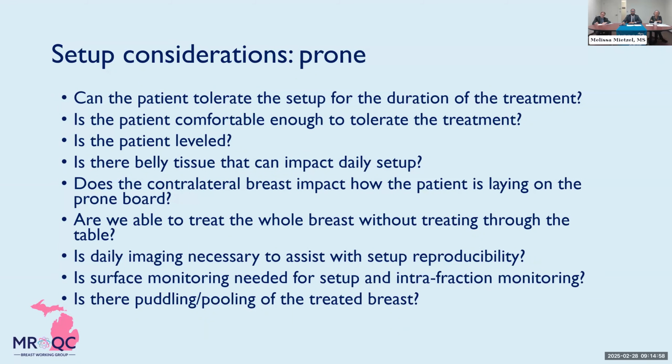Does the contralateral breast and how the contralateral breast lays on the board impact how the patient is laying on the prone board and therefore also impact daily setup? Are we able to treat the whole breast without treating through the treatment table? Is daily imaging necessary to assist with setup reproducibility? Are there technological options like surface monitoring that is needed for setup and intrafraction monitoring? Or finally, is there puddling or pooling on the treated breast that needs to be addressed?